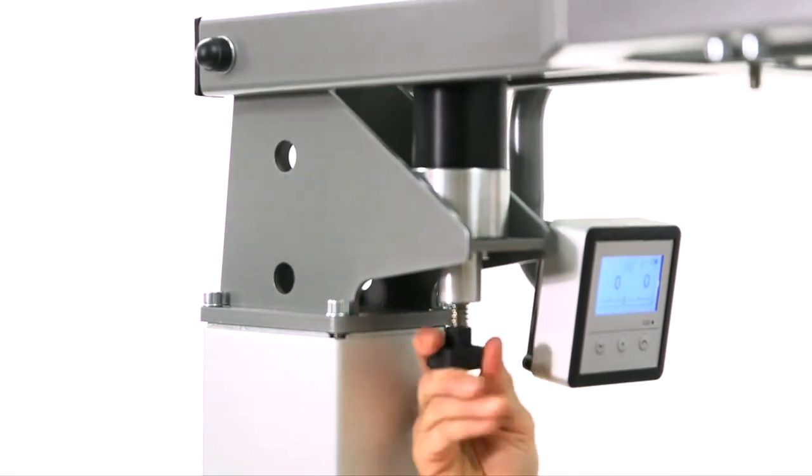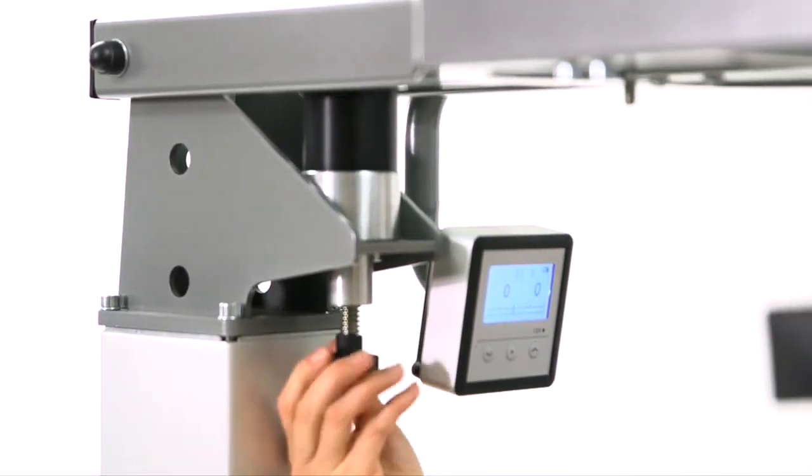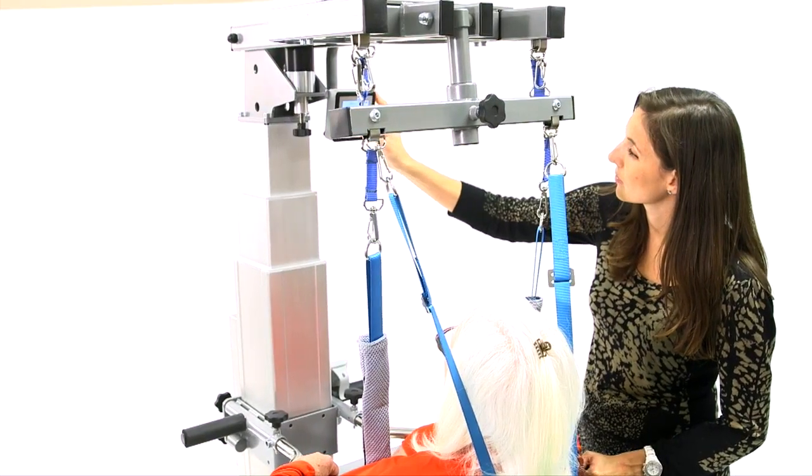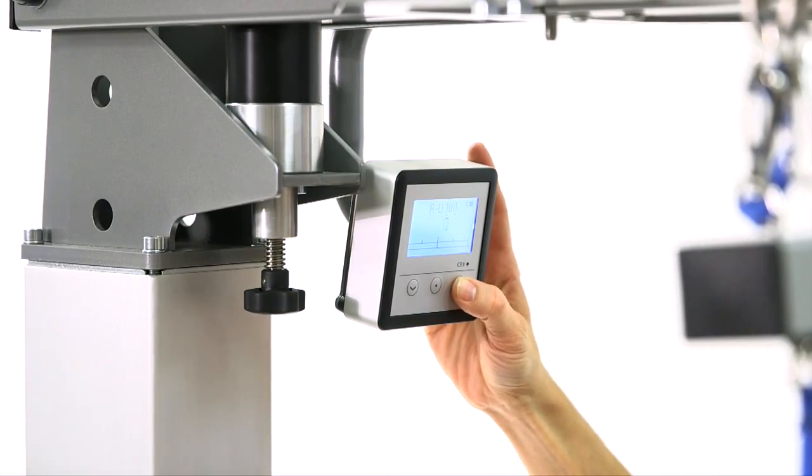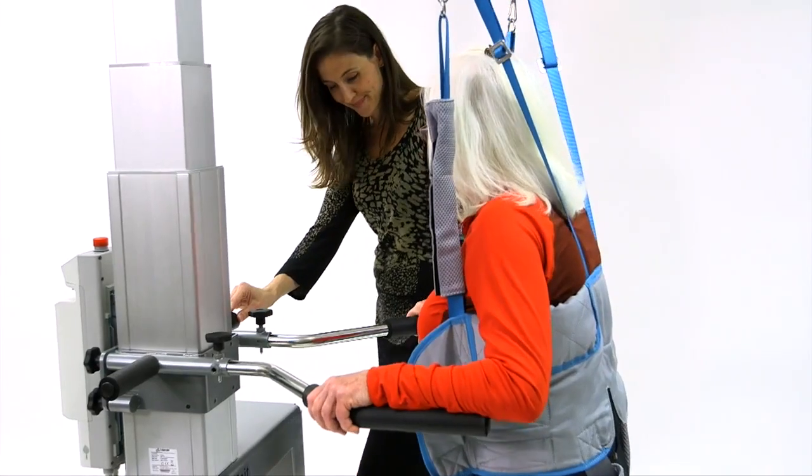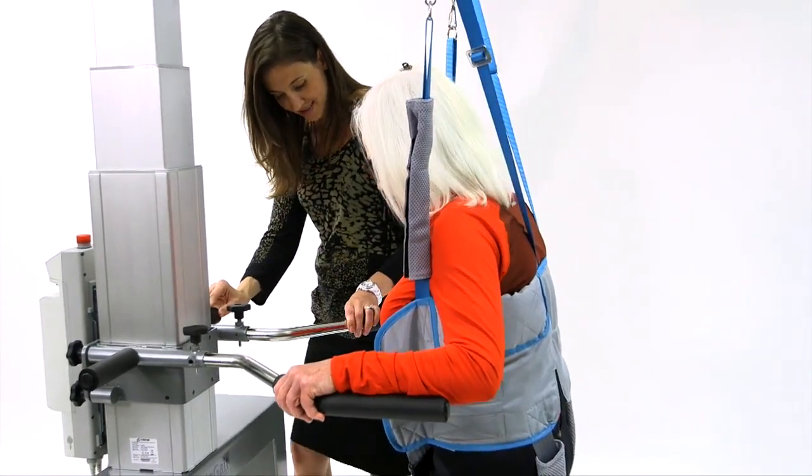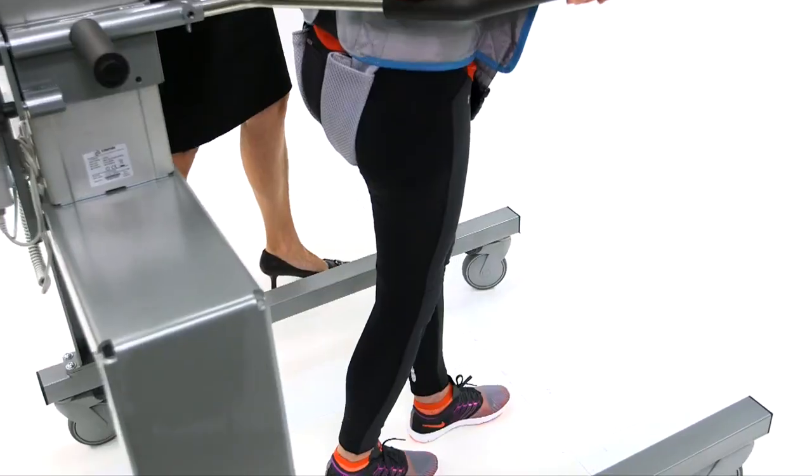Using the gait scale, the clinician measures uni- and bilateral gait displacement. The LCD gait scale has three modes: one displays total weight, two displays left and right weight, three displays differential weight between left and right side.